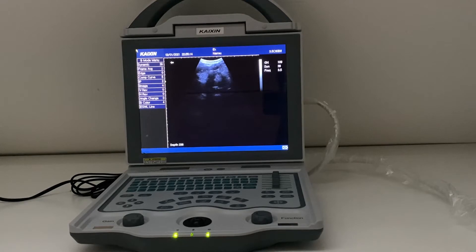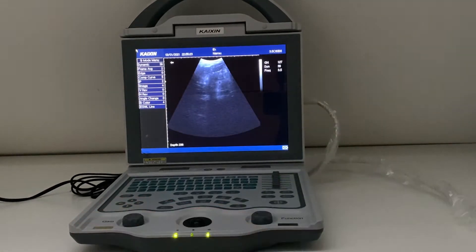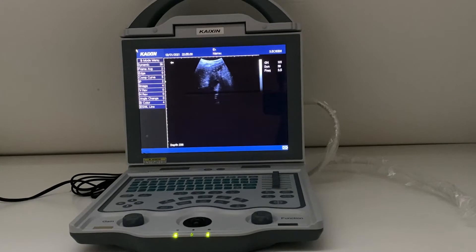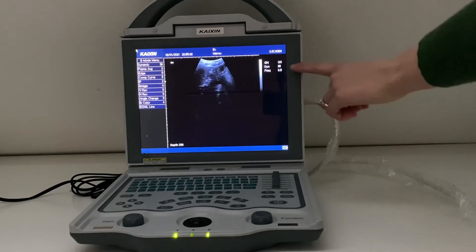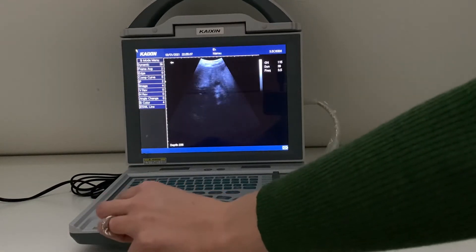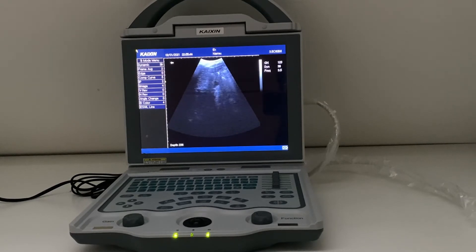The most important controls when you first start are gain and depth. Gain is changed on the left hand knob. Turn your gain up and the image becomes brighter; turn it down and the image becomes darker. Pay no attention to the number on the right hand side — it really doesn't matter. Just change it so you can see what you want to see. Liquid should be black, bone and gas should be white, and soft tissue will be other shades in between.